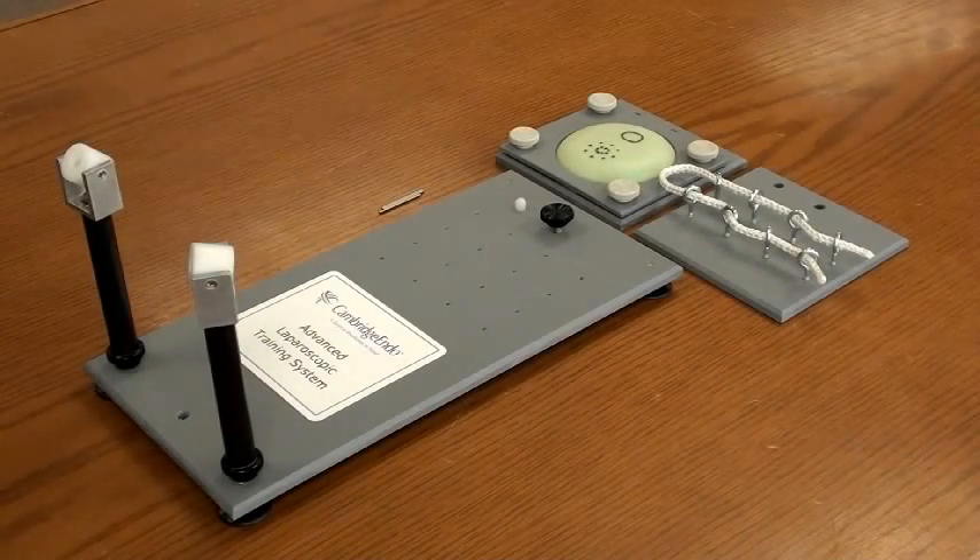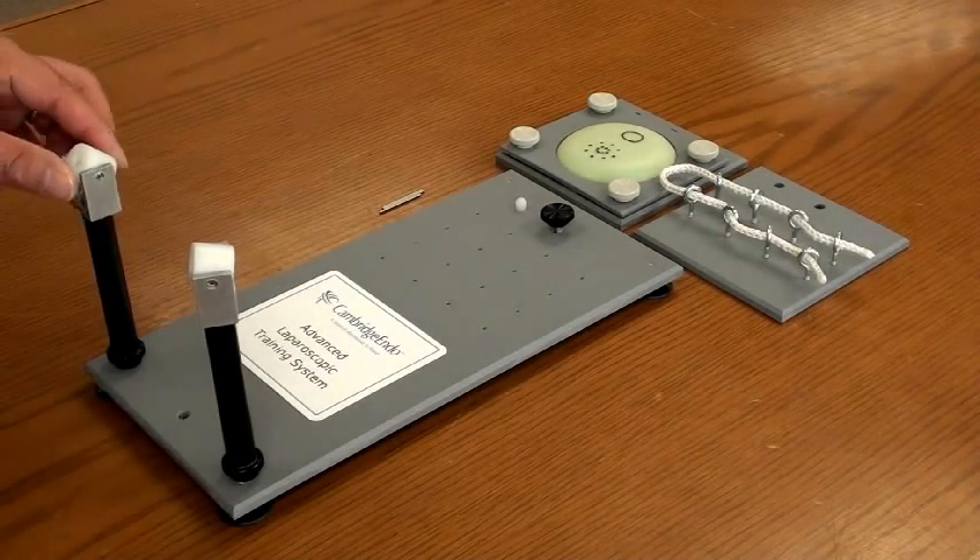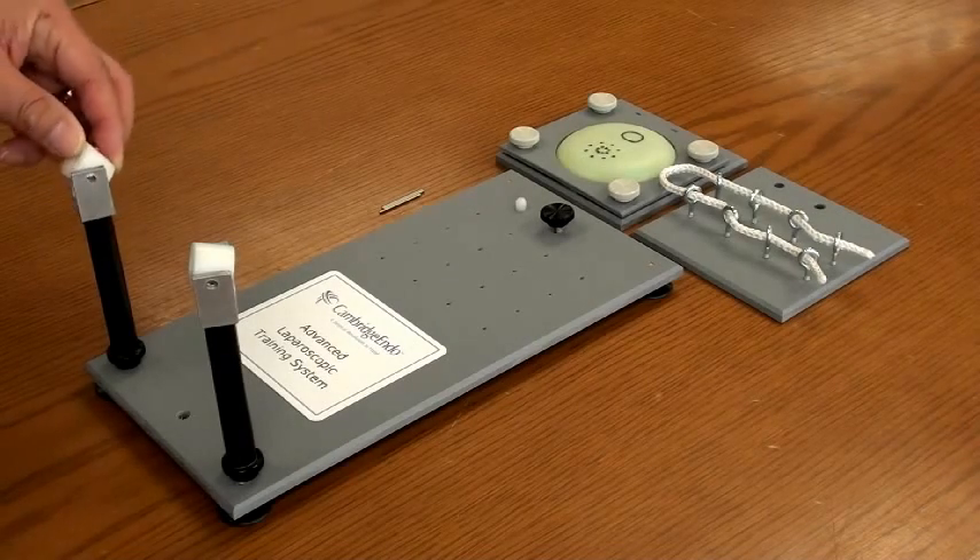Here's the Cambridge Endo's Advanced Laparoscopic Training System. The training system consists of the baseboard and the two trocar posts, which simulate the skin incision points.